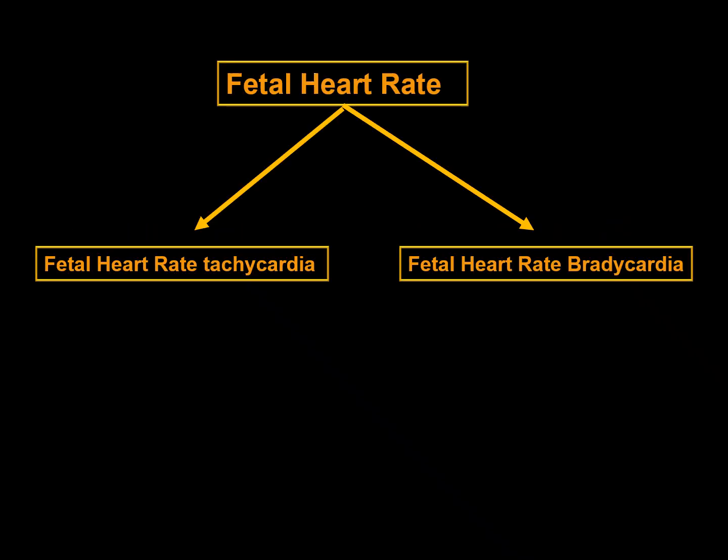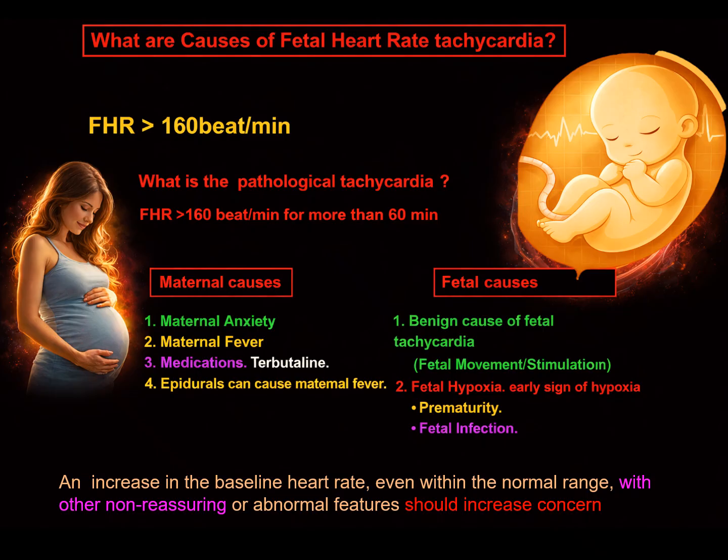It varies in the abnormality between the fetal heart rate, fetal heart variability, presence of deceleration and type of the deceleration, and others. Fetal heart rate difference can be either an increase in the heart rate, which is tachycardia, or a reduction in the heart rate, which is bradycardia.